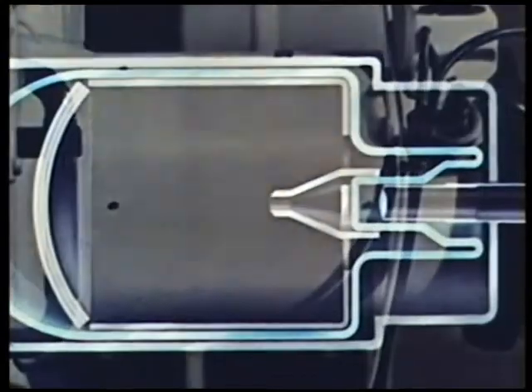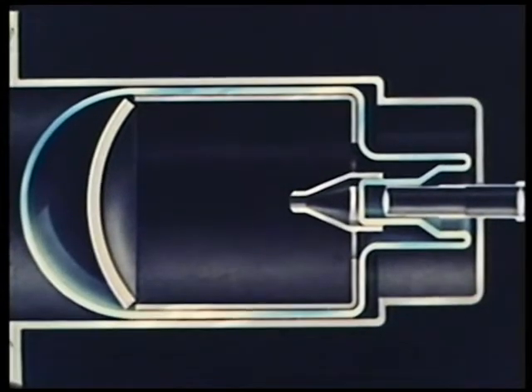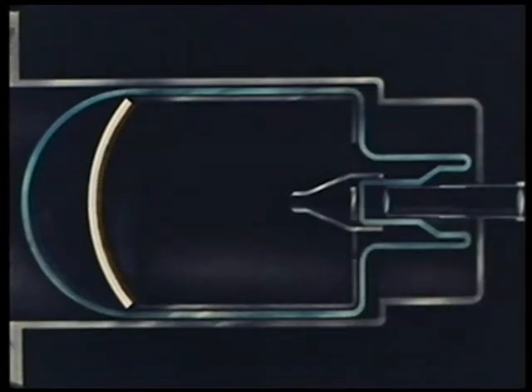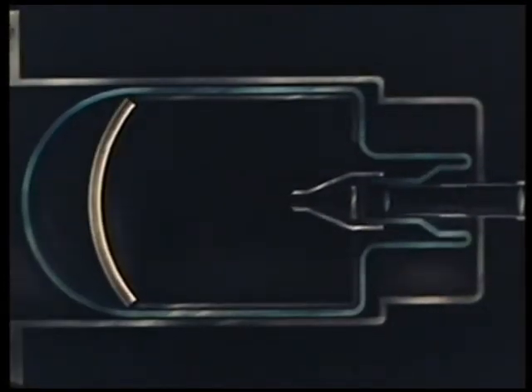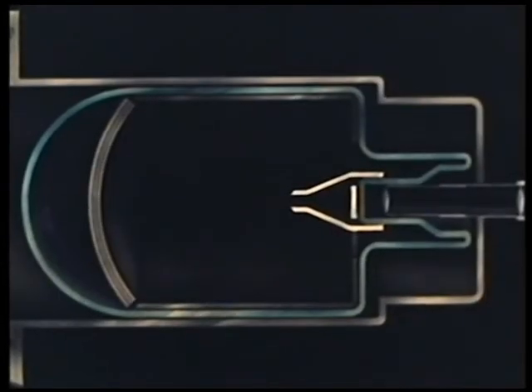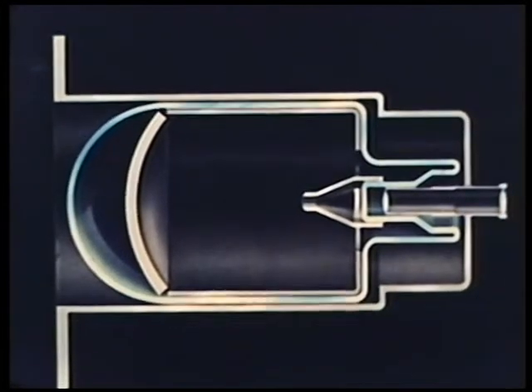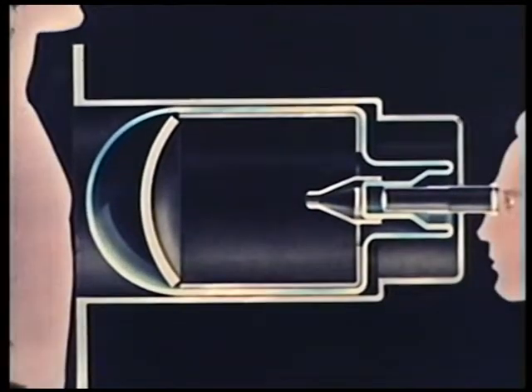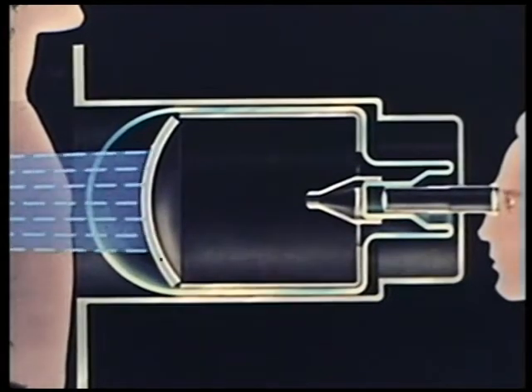Inside a protective case is the image intensifier tube. In the interior of a vacuum glass container is an X-ray fluorescence screen mounted on a thin aluminium frame. In contact with the X-ray screen is a photocathode, opposite which is an anode connected with the observation screen. The X-rays penetrate the patient and produce on the fluorescence screen an electronic image.